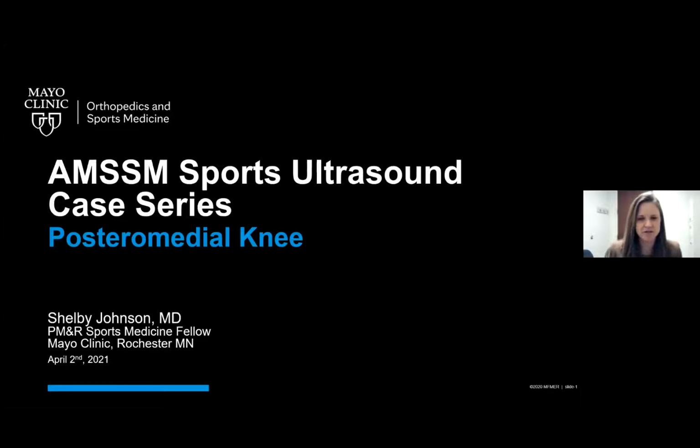And thank you to Dr. Cruz, Dr. Hoffman, and Dr. Hall for inviting me to present a case for this awesome series. As Dr. Cruz said, I'm Shelby Johnson. I'm the PM&R Sports Medicine Fellow at the Mayo Clinic in Rochester, Minnesota. And today I'll be going over the ultrasound evaluation of the posterior medial knee in the context of a patient I saw this year.